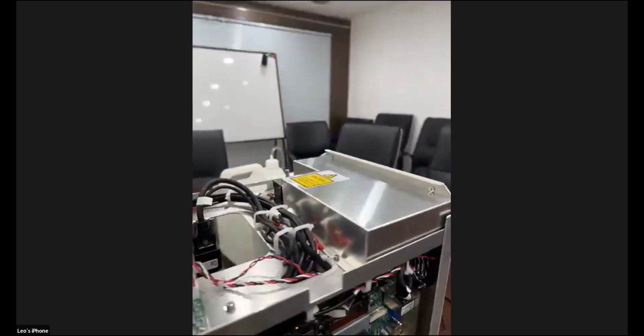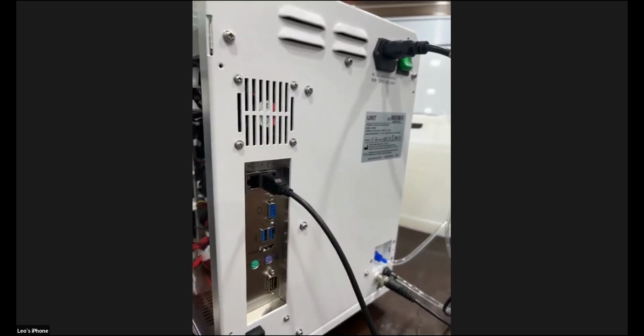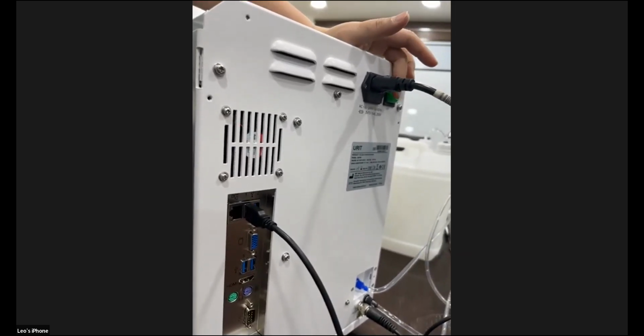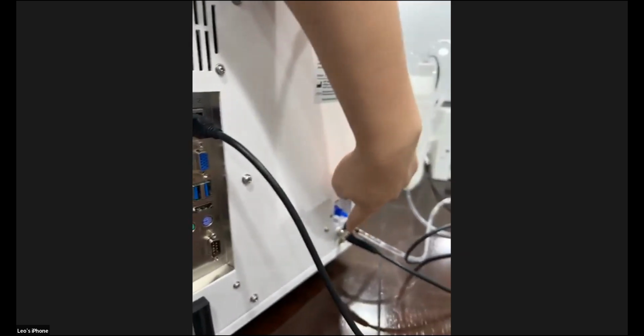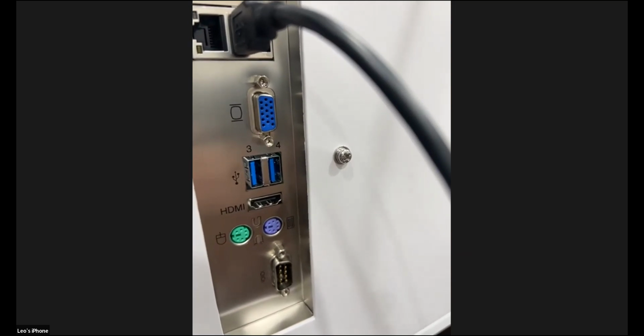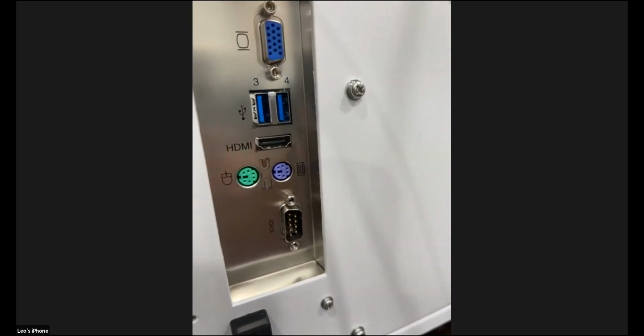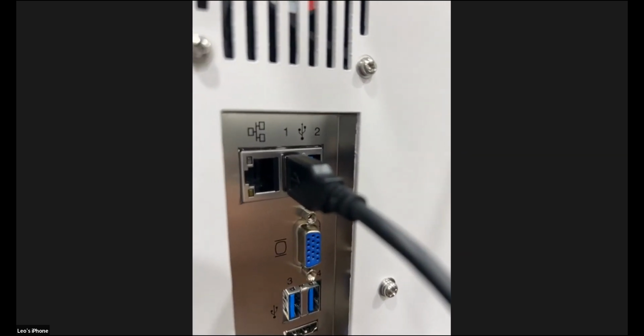Okay, this is the rear view. The rear view is very simple. We can see the power switch and the power cable. We also have the reagent and the waste tube connector, and the waste detector. And then we have some connectors, including the USB and the PS2, and also we have the RS232 communication cable. Also, we have the NET cable connector.